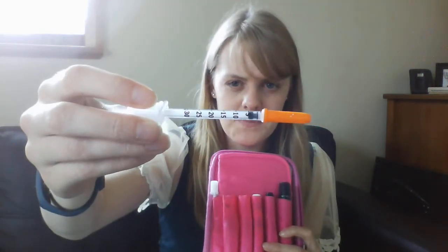Next, so much stuff in here. We'll move over to this side. So normally this is where all your pencils go, but obviously I'm not using it for pencils. So I carry some syringes. We can wiggle them out of there. Just these wee ones here. Just in case my pump breaks, then I need to be able to give myself insulin manually, and that's what these are for. So I've got 2 of those, just in case something really disastrous happens.